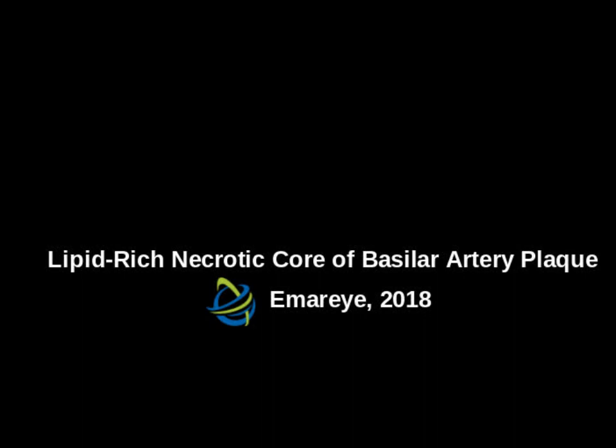I am going to present about the lipid-rich necrotic core of basilar artery plaque. The MR imaging of a lipid-rich necrotic core is very important when evaluating the response of lipid-lowering therapy. As we all know, lipid-rich necrotic core plays a key role in progression of arteriosclerotic plaques, especially in carotid arteriosclerotic plaques. In our study, we use contrast-enhanced T1 weighted imaging to evaluate the LRNC.